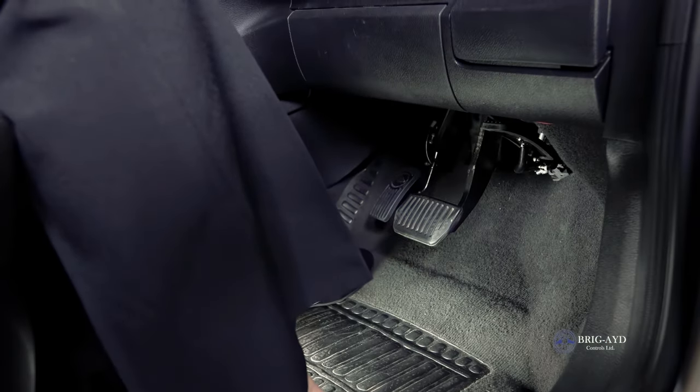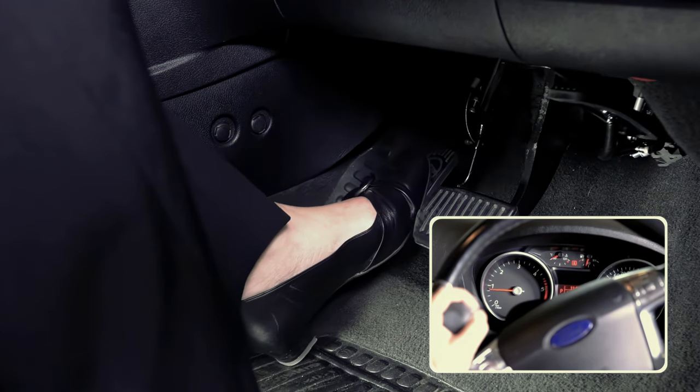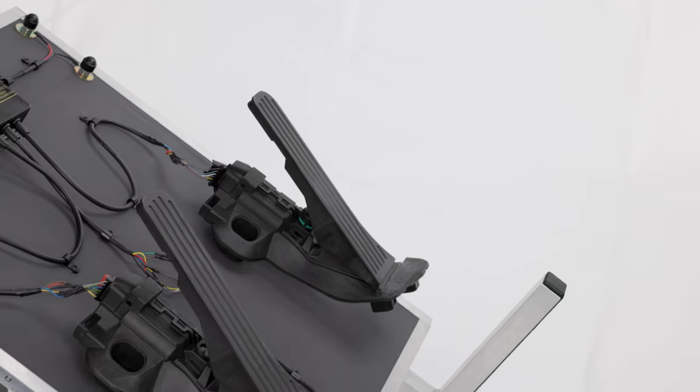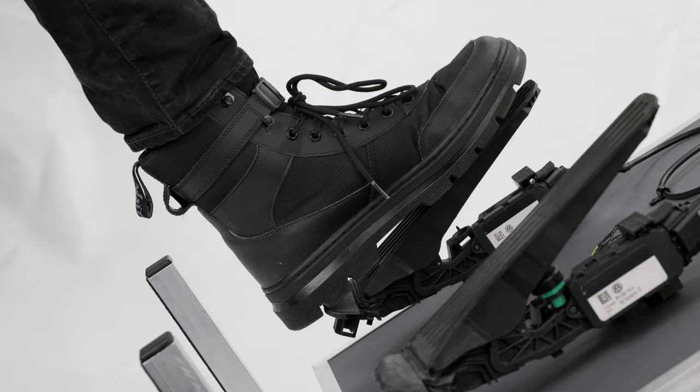A twin flip accelerator allows the right pedal to hinge up and out of the way while the left is in use. The right can be operated with the left up and out of the way. An electronic left foot accelerator simply provides an additional pedal on cars with floor mounted pedals.